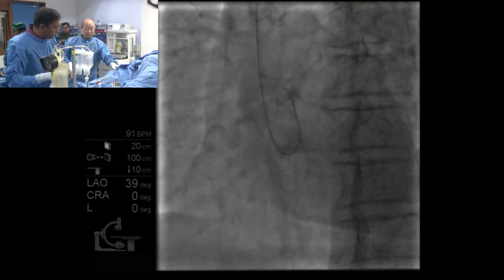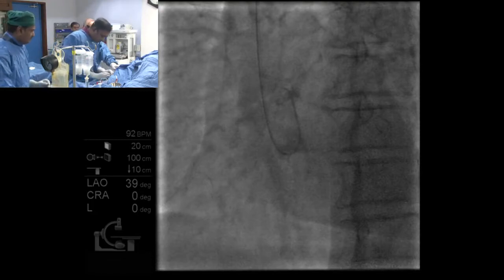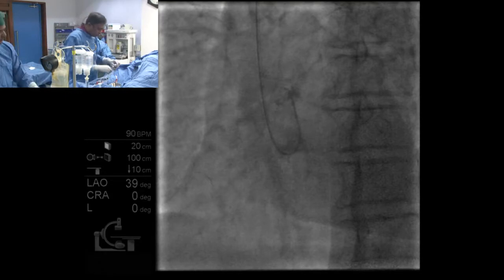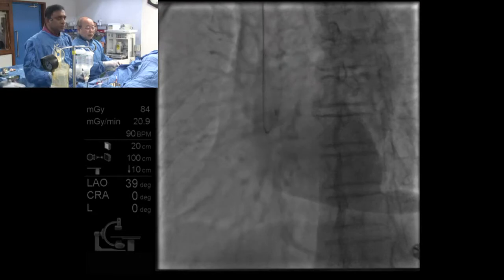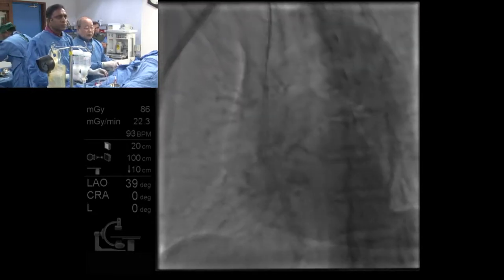You lose your distal pressure completely. You don't know what you're doing. Yeah, exactly. Don't say that to the side. Feel a kick somewhere. You don't know where. Okay. We made 2 side holes in this catheter by using a needle puncture.